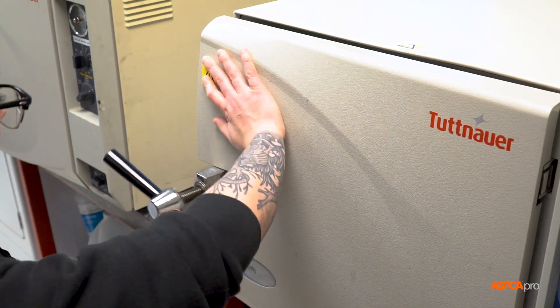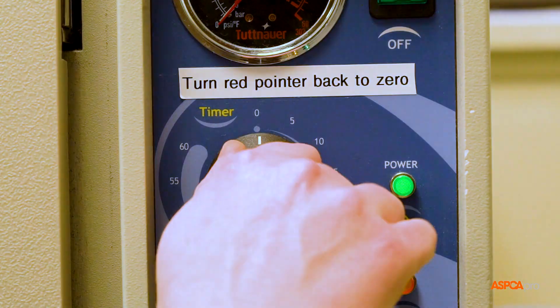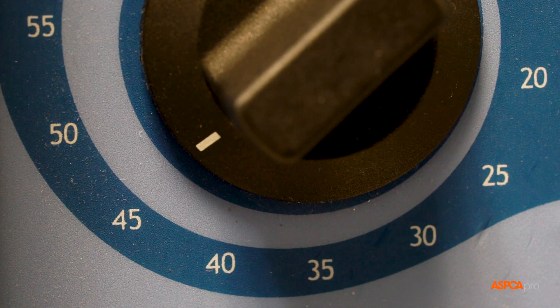Close and tighten the door bolt screw, ensuring it is snug but not over tight. Set the timer according to the manufacturer's instructions.